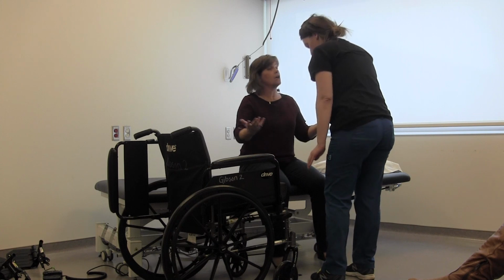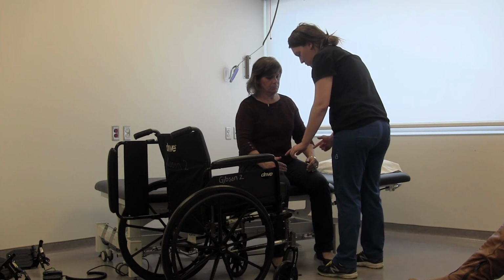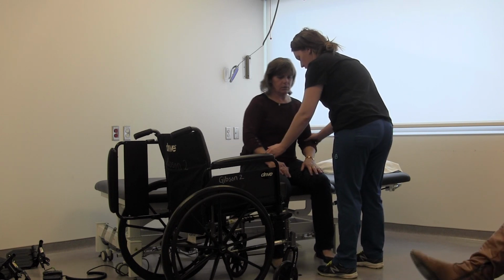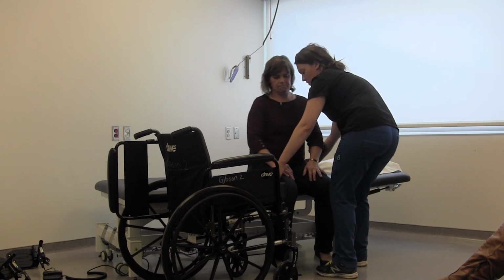So the first thing, I'm going to talk you through it. First thing is to bring their hips to the edge. Just going to say, can you? Which side do you want, my affected side? This side? Okay. So rock your hips. That's it.